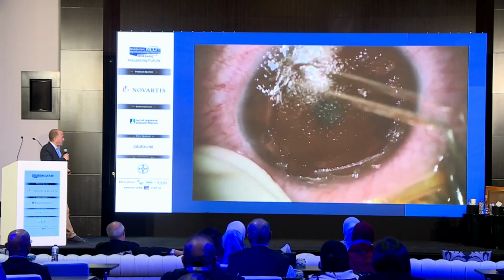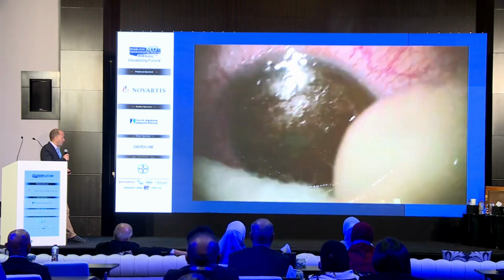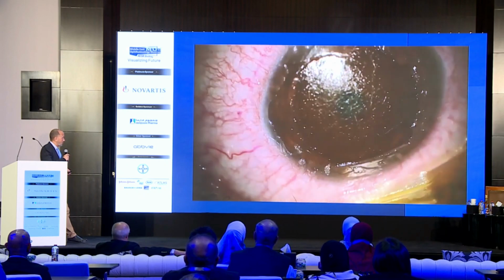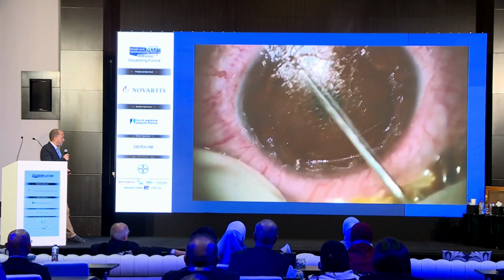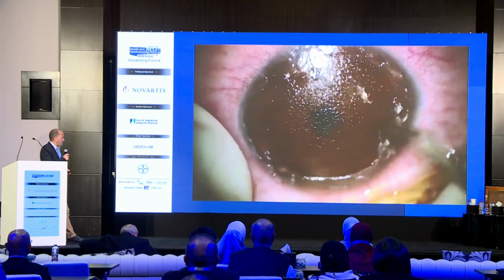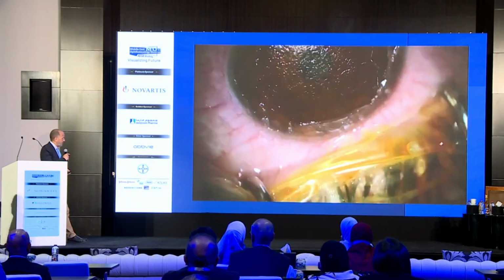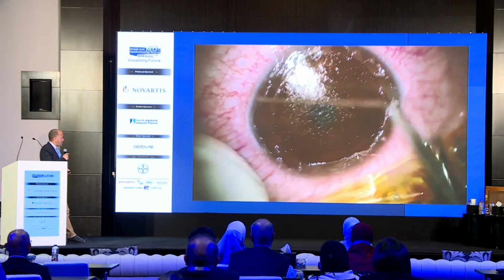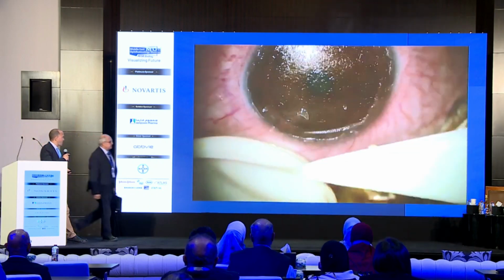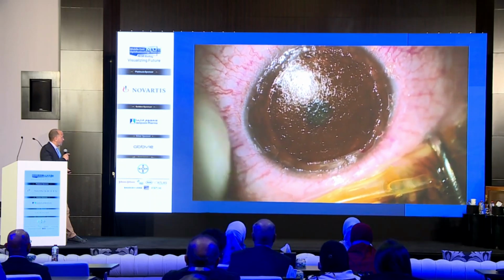Left the patient with no epithelium at all, with a bare stroma. The lower part had the epithelium. It was an over-exaggerated thickness of the epithelium in the lower part because there was no stroma there, it was melting. And that was pretty much what we did. Put some betadine eye drops and contact lenses. And that's that. Okay.